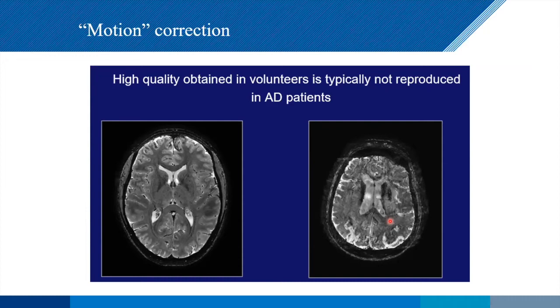So you think, well, this is probably because the patient is moving, but we don't see any gross effects outside, which you would expect. You'd expect to see some ghosting in the phase encoding direction. You just don't see that. So what's actually going on?